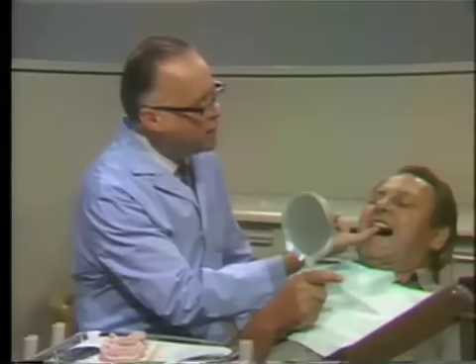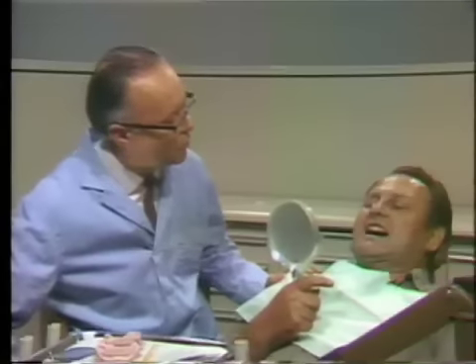Another thing is that we want to keep the maximum amount of room on the tongue side here for your lower teeth to come up into relationship with that, so that you won't be able to close together at the moment because of the attachment on the back of that. So you think that would be all right so far as you're concerned? Yes, looks nice. Good, fine.